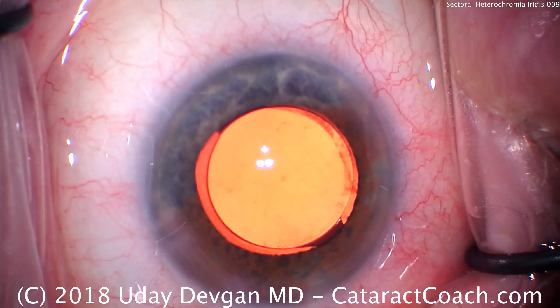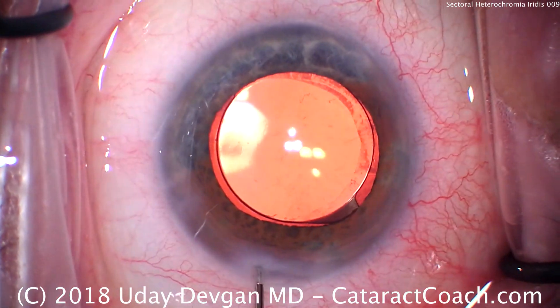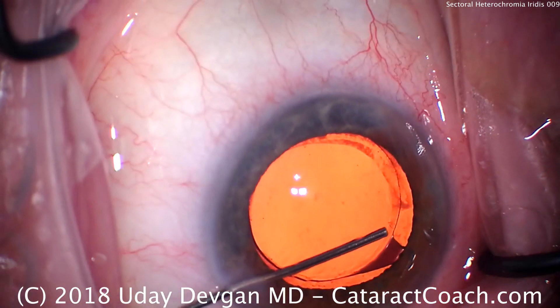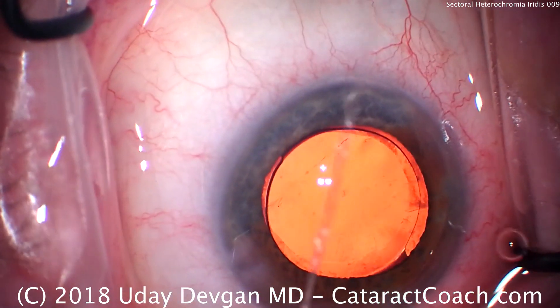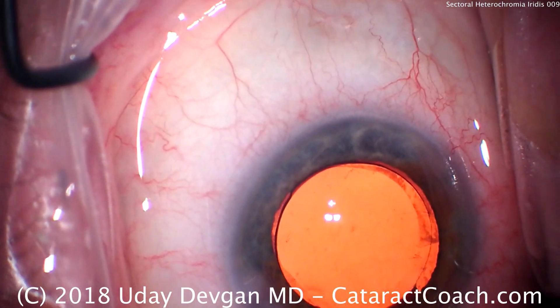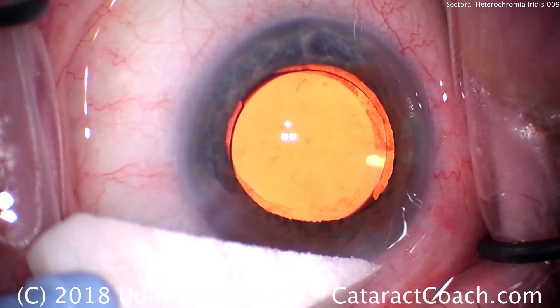A little hydration of the incision back and forth — we want to avoid doing too much hydration. Now for the paracentesis, making sure there's no retained viscoelastic or nuclear chunks. That looks great. Seat up the paracentesis and we can put some sponges to check the incision — make sure everything looks great. Interesting case in a patient with heterochromia.